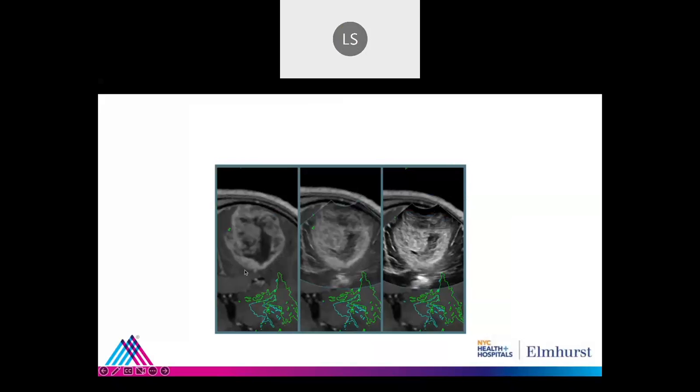And this is one case where we can see the transition. We have the preoperative MRI. This was the corticospinal tract, and this was the arcuate tract. And we can see how, playing with the window, we can go from this to the ultrasound, and it's pretty much the same. You can see the same structures, and the quality of the picture is very similar. You can also see the choroid plexus in here.